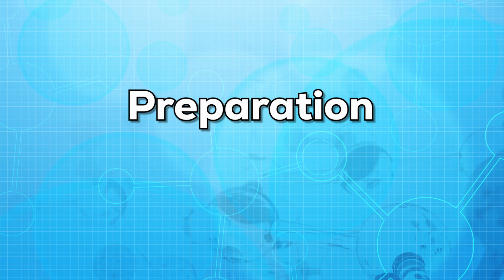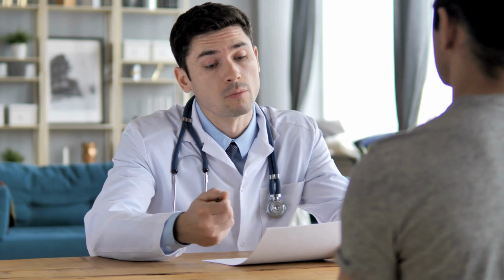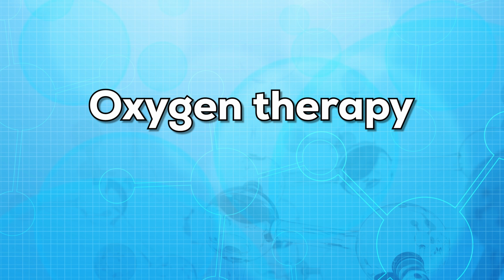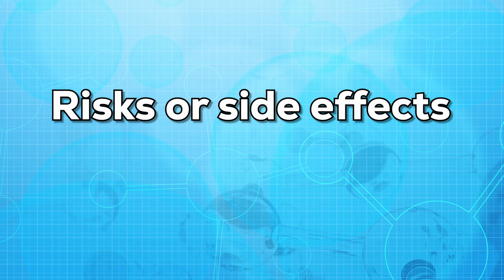So, how can you prepare for this test? For this test, you must inform your doctor about all the medications, vitamins, and supplements that you are taking. If you are on oxygen therapy, then you might need to stop taking oxygen for 20 minutes. It might feel a bit uncomfortable in the beginning, but later it would be okay. So, are there any risks or side effects in this test? This test requires withdrawal of blood. There are no major side effects, but make sure the needle is sterilized and the area is well cleaned.